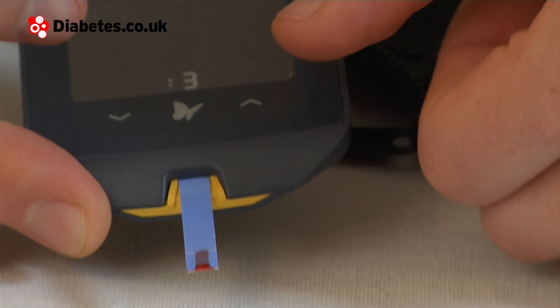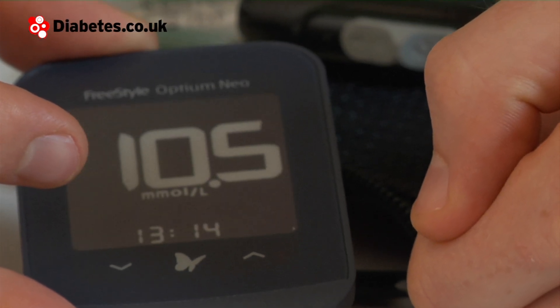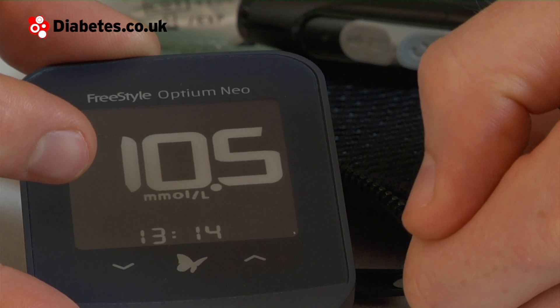The bars disappear and you'll see a countdown. It's given me my result — a little bit on the high side, but that's fine.